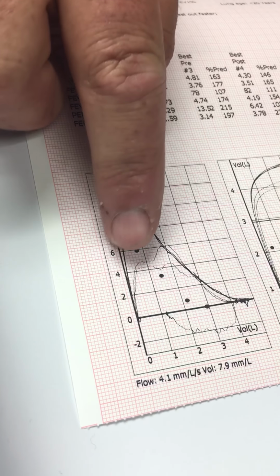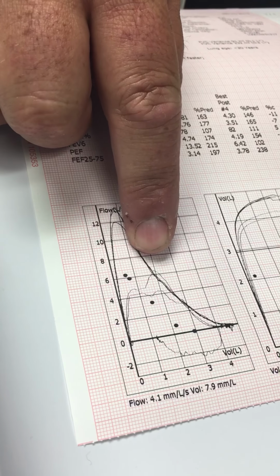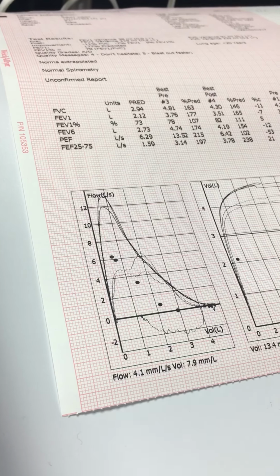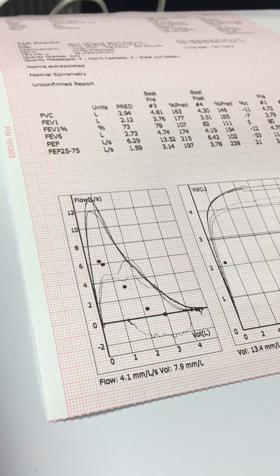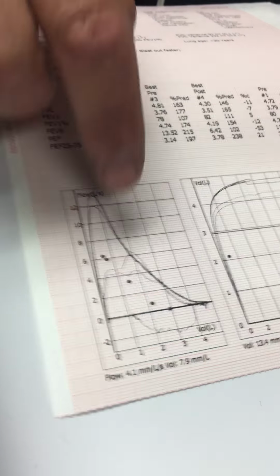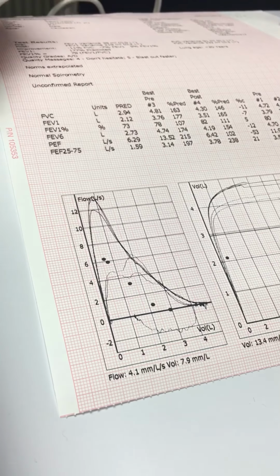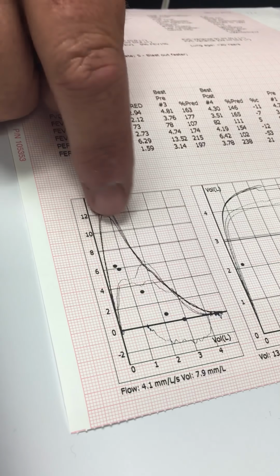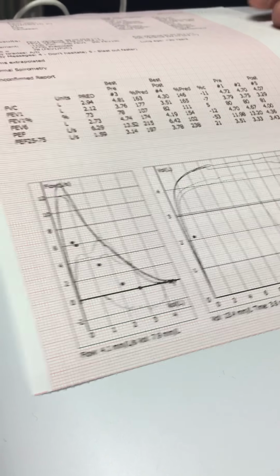So you can see down here my post tests were garbage. The peak occurred way out here. That's a bad test, but that could be what that patient is capable of. As long as it's consistent, that's what we're looking at. You can see my post tests, not so consistent. My pre-tests, pretty consistent. You can see the 3 lines. 2 are almost on top of each other. 1 was a little low. So, make sense so far?